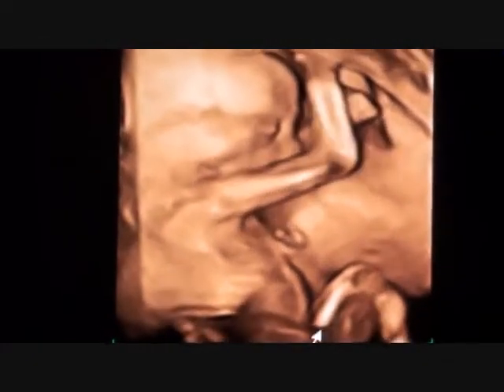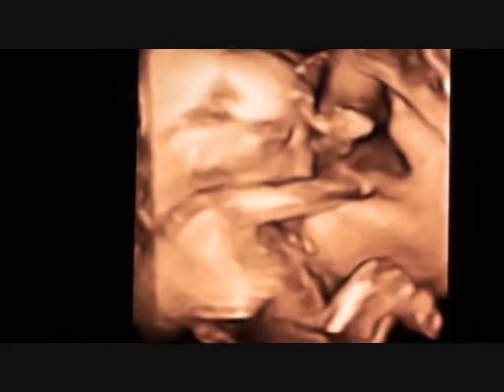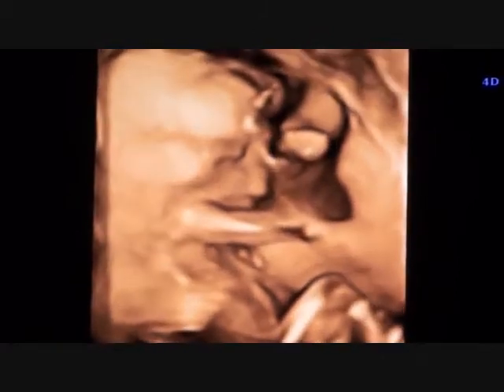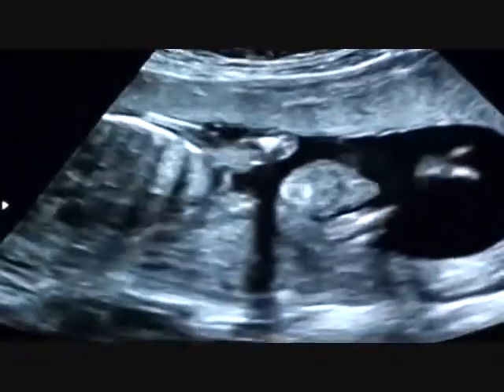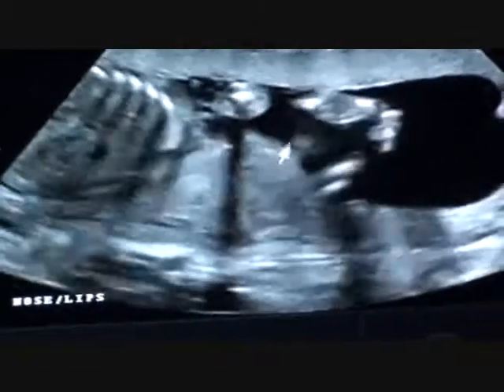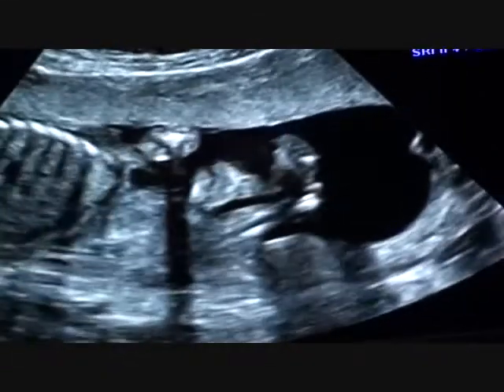They've got bones and skin right now. Let's get that little arm up — just going to hide. That's how I need his nose and lips. Look at them back there — look good. I like to make sure there's no obvious cleft lip. So far nose and lips look good — we'll get to see them a little bit better later on, but so far they look normal. They're just peeking in back in between these two little arms. You can see nostrils, top lip and bottom — so far they look normal.